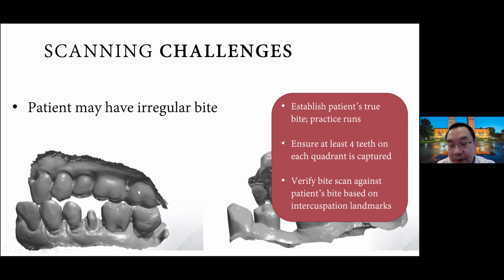And then after you take the bite scan, verify that bite scan against the patient's bite using some intercuspation landmarks. For example, I can use the distal buccal cusp against the buccal groove right here. I want to verify that's the same intercuspation in the patient's bite.